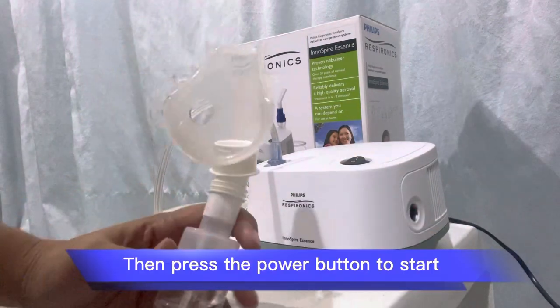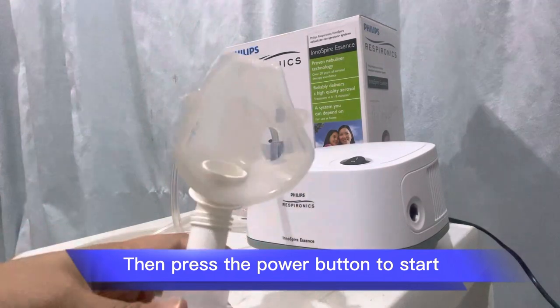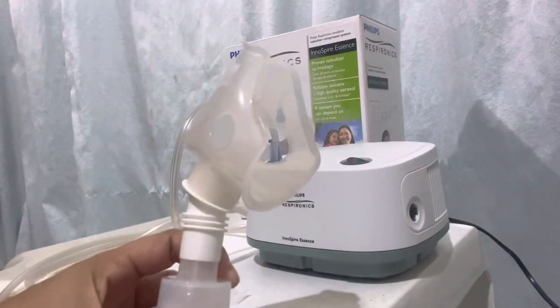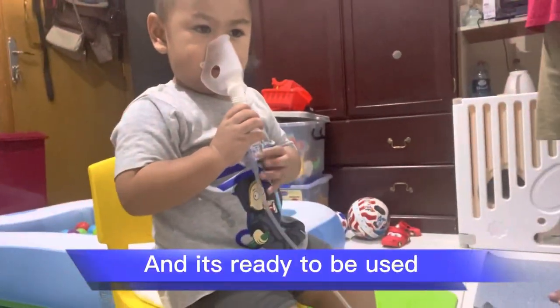Then press the power button to start, and it's ready to be used.